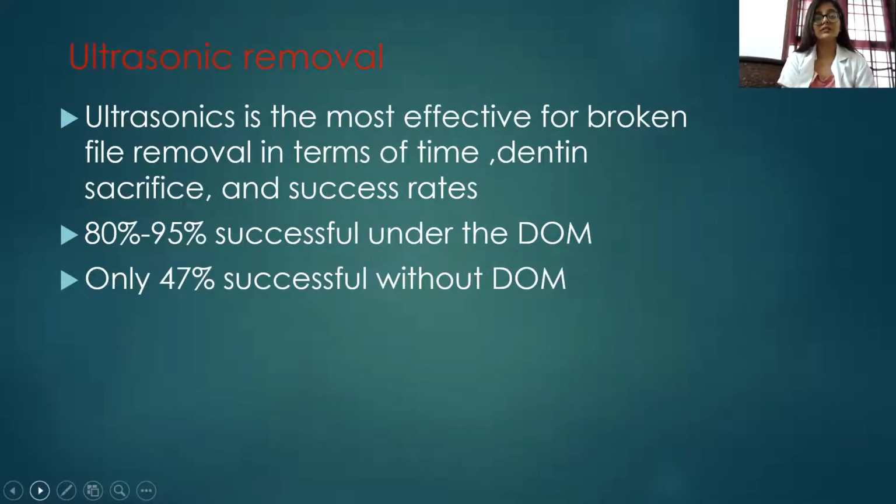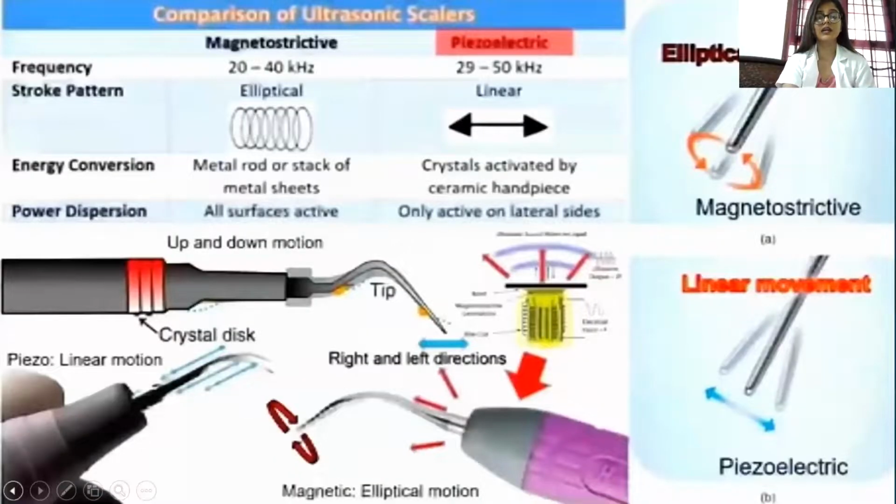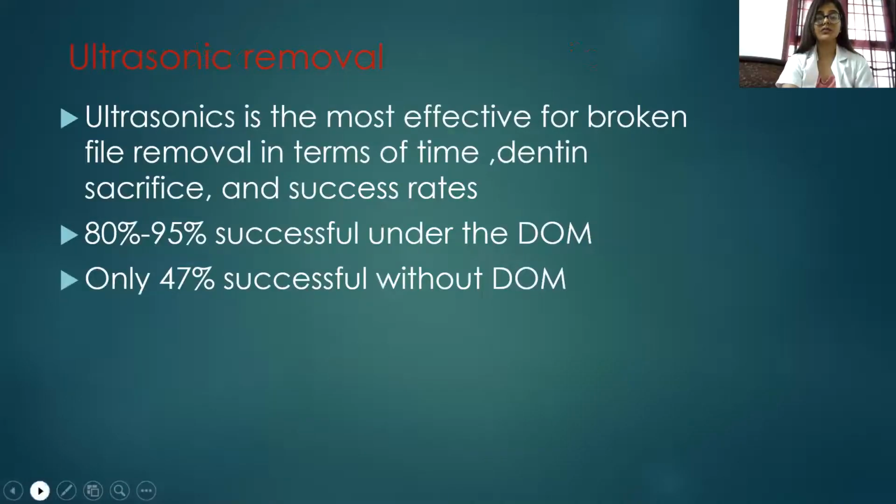Ultrasonic removal. Ultrasonics is the most effective for broken file removal in terms of time, dentin sacrifice, and success rates. 80% to 95% successful under the microscope, only 47% successful without the microscope.